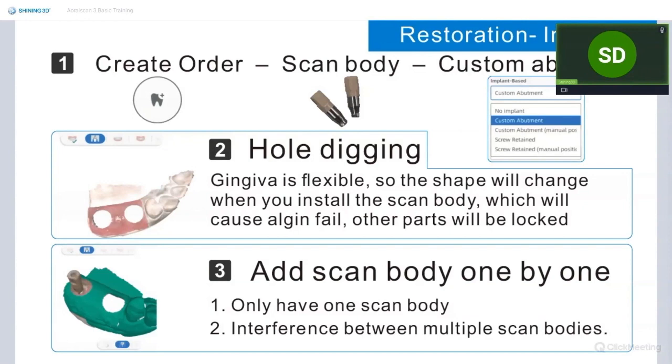How do you turn the scan sound on when scanning? The scanning sound is automatically on. That da da da da da sound. Do you have a rapid scan function on?